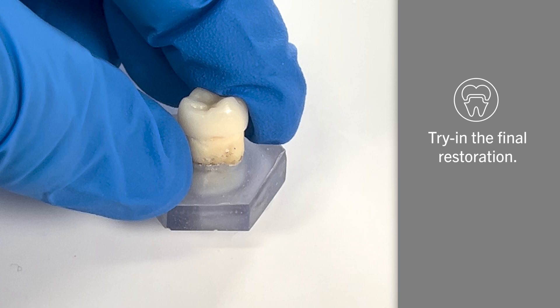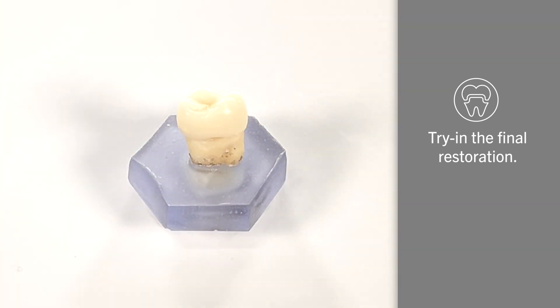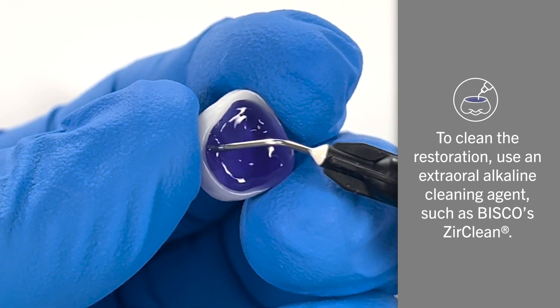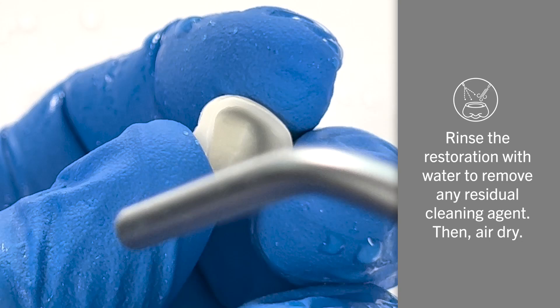Next, try in the final restoration to guarantee a proper fit. To clean the restoration thoroughly, we recommend the use of an extraoral alkaline cleaning agent, such as Bisco's ZirClean. Rinse the restoration with water to remove any of the residual cleaning agent.